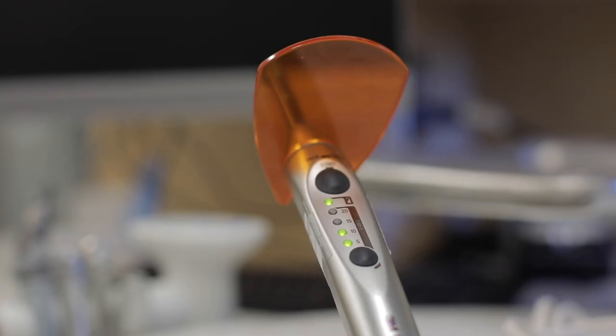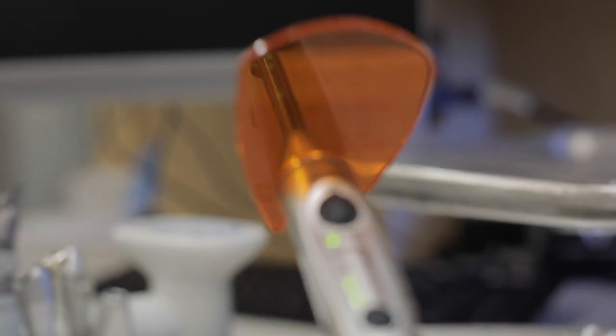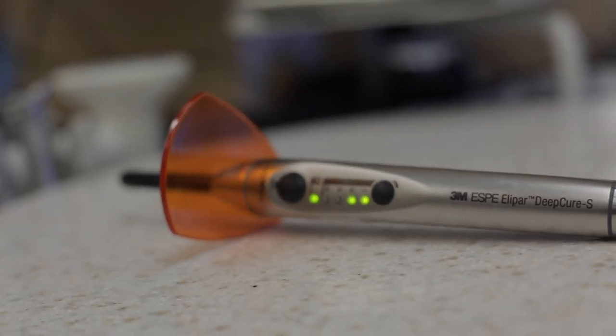Even just seven glances at that light per day actually exceeds the maximum recommended dosage of blue light exposure for a given day. The take-home message: do not look at the blue light. Make sure you're using some type of protective shield — blue light blocker glasses or a blue light blocker mounted on your curing light. The person operating the curing light should use that blocker, and the other person should just look away.